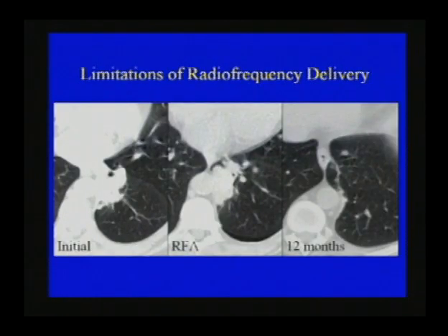In addition, there is another limitation with radiofrequency ablation. You can only really treat one tumor at a time in a region. And so here you see a case that we took on. This had a couple of other issues for us.